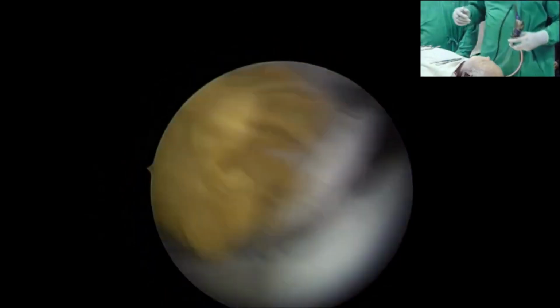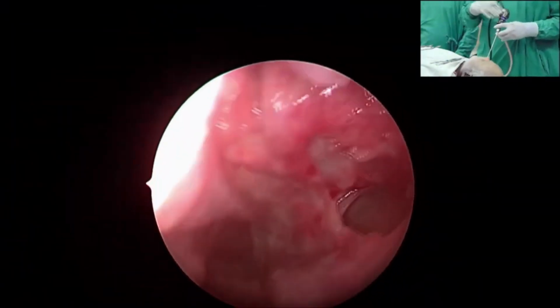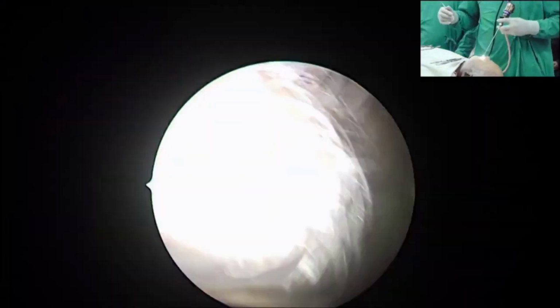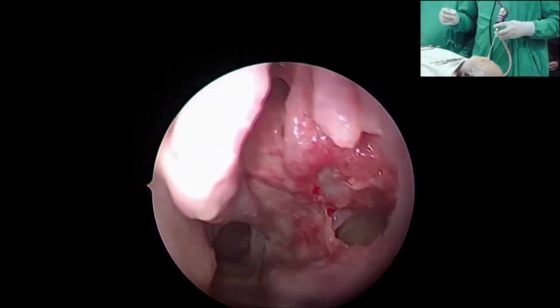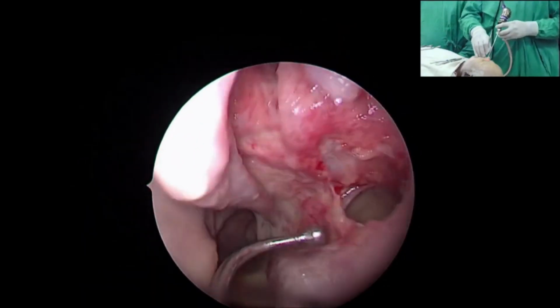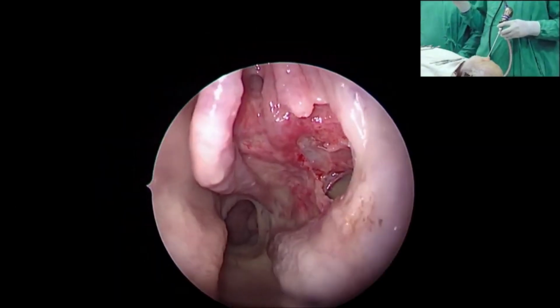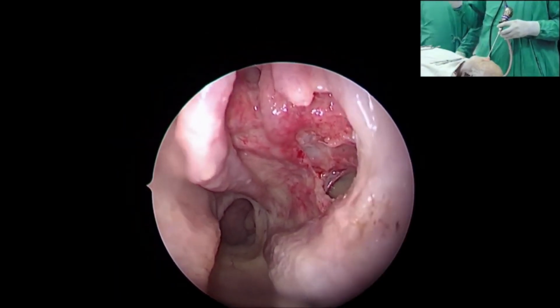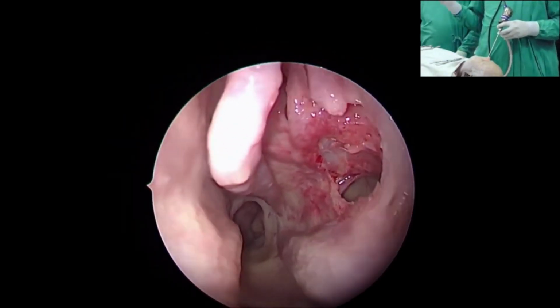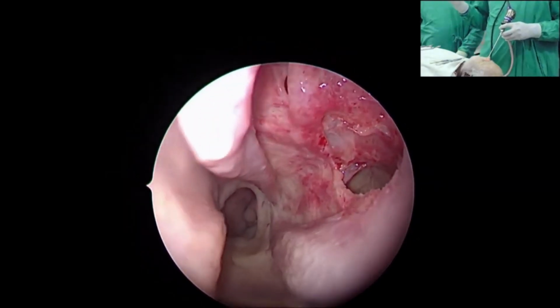Yes, that's a very important point you have highlighted. And that is something, a message to the colleagues, everyone, that preserve the mucosa. That is most important. It's not the size that matters. The size doesn't matter for function. Function matters. That is the take-home message. It is the size which doesn't matter that much as compared to the function preservation by means of preserving the mucosa. That is most important.